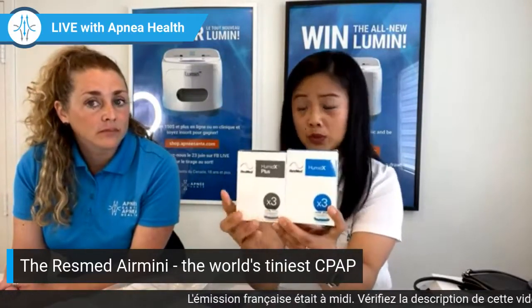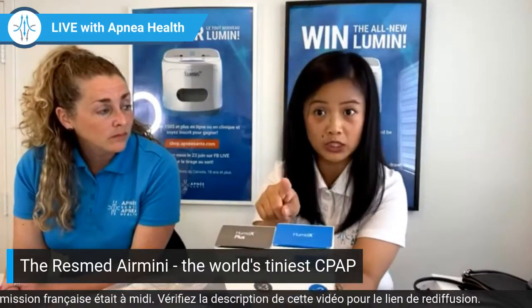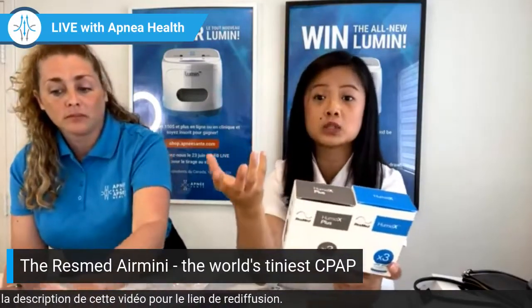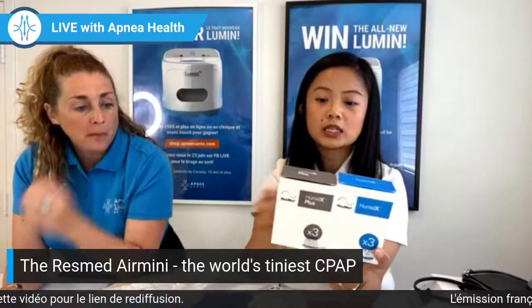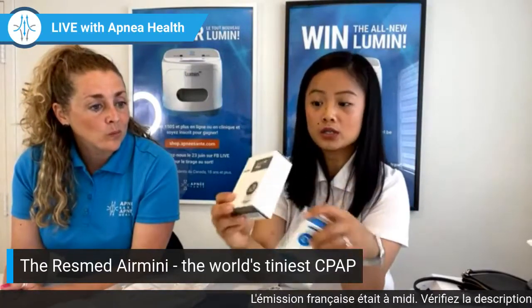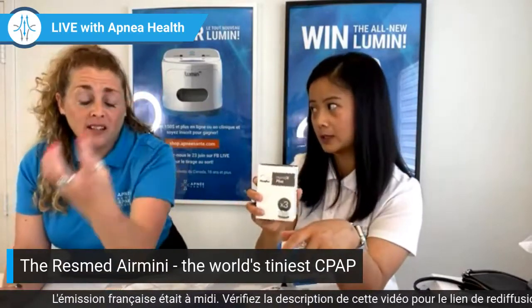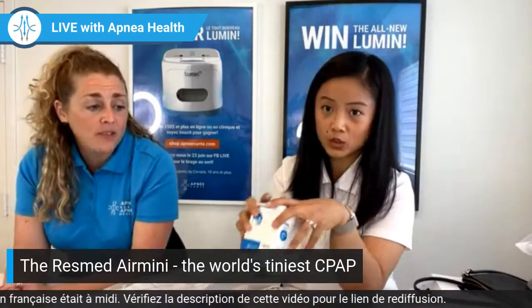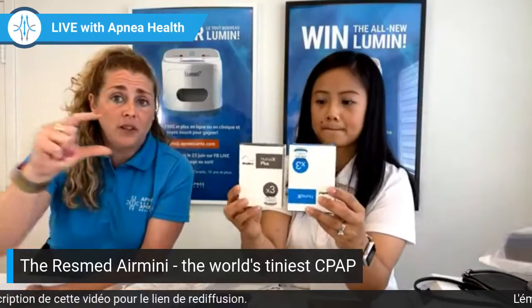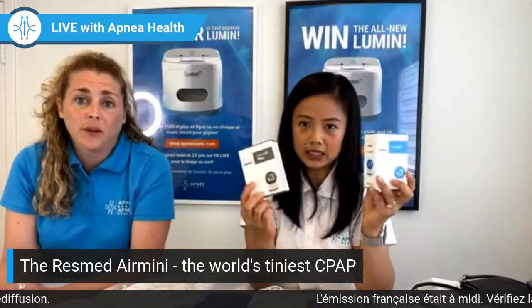These have to be replaced every 30 days. And I'm not talking about 30 days of usage. It's 30 days from once opening the filter and exposing it to air. Like I said earlier, it's a bit like a sponge that absorbs humidity, so it also absorbs humidity from your room. That's why it has a shelf life of 30 days. It's constantly absorbing, and once saturated, it's no longer useful. When you take the puck out, it does say it must be changed after 30 days of opening. So it's very important.